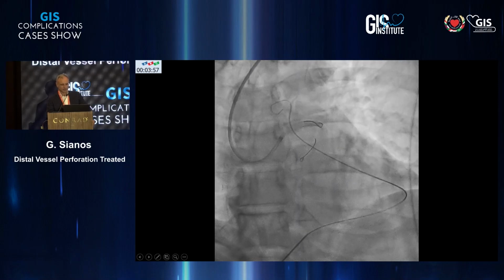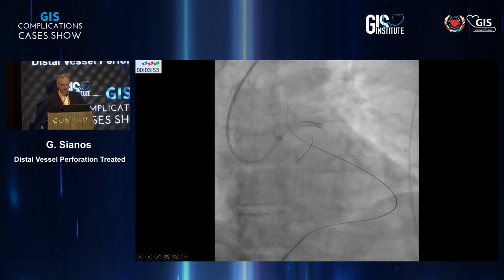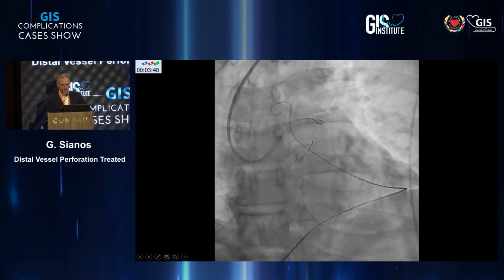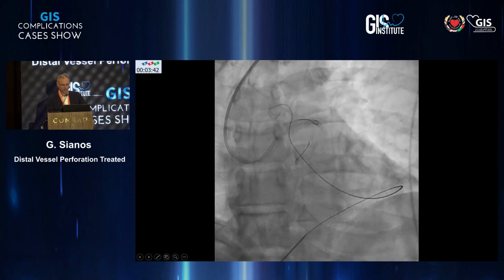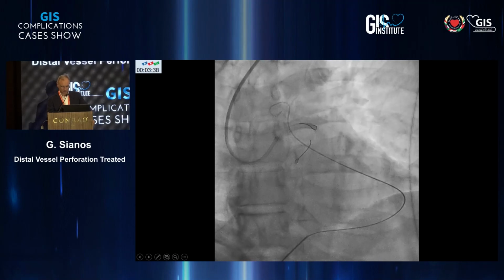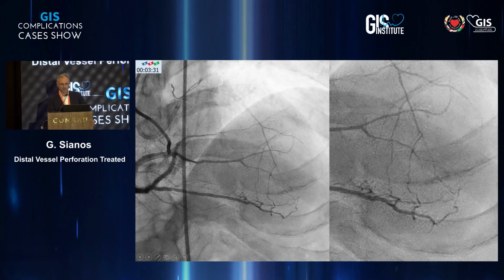So it took some time actually to puncture, thinking a little bit this, that. Anyway, tap was done. There was no really hemodynamic compromise, not a very big amount, around 200 ml was aspirated and was given through the femoral vein. And that's the situation, as I told you, the collateral circulation that I analyzed before.